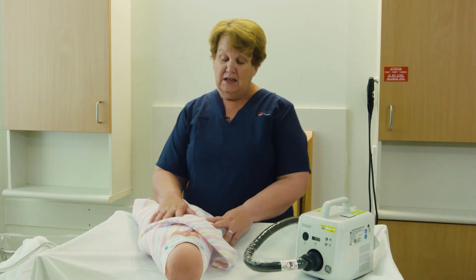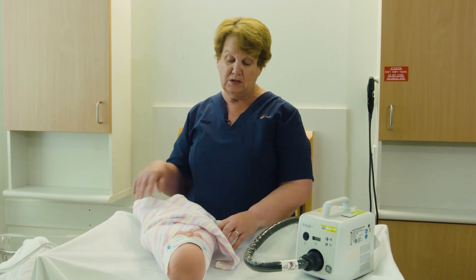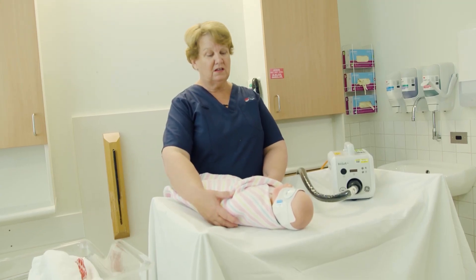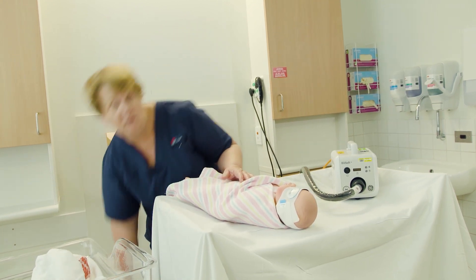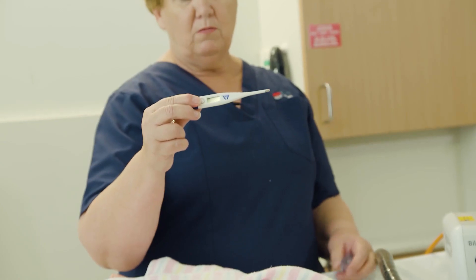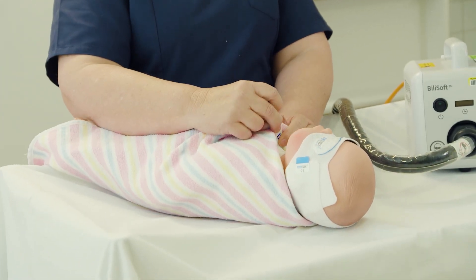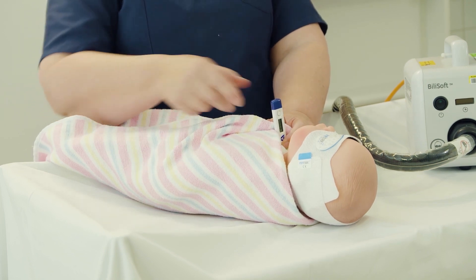The environment plays an important role in keeping your baby warm. If it is winter or if the temperatures happen to be cold, you may need to put a secondary blanket over the baby to keep it nice and comfortable. We check the temperature with every feed. Before the feed, we will supply you with a thermometer — this is placed under the baby's arm. Press the button, wait for three beeps, and it will give you a read.